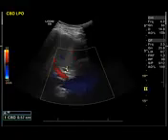They measure it from where they see the margin of the common bile duct to the opposite margin. It should be leading edge to leading edge. We'll talk about that when you come in. Now, we're looking on the sagittal plane at the kidney. The kidney has a normal appearance when it has a nice, bright, echogenic central sinus.